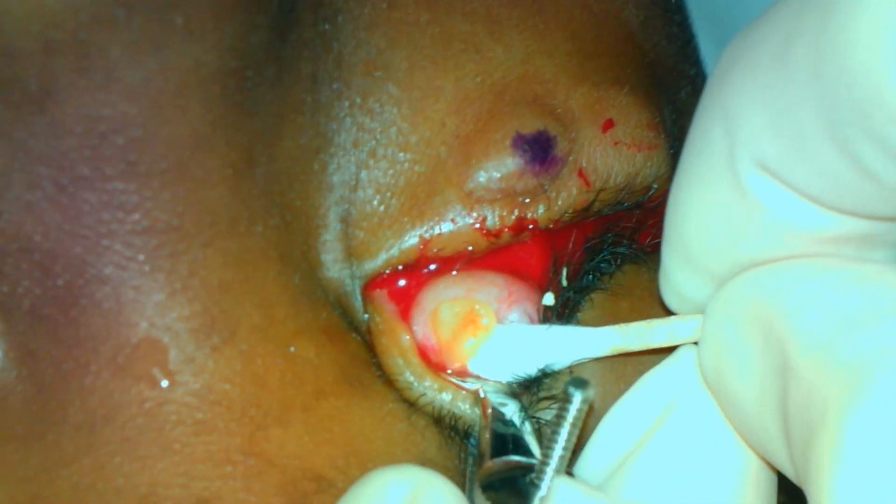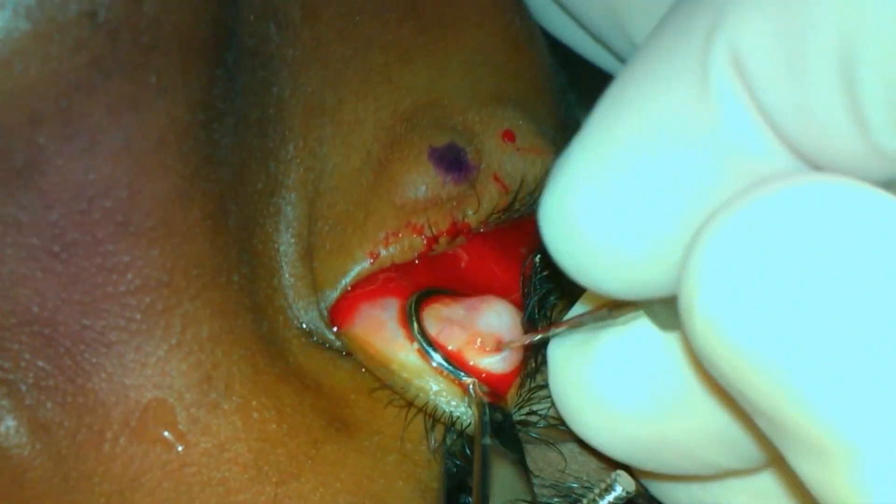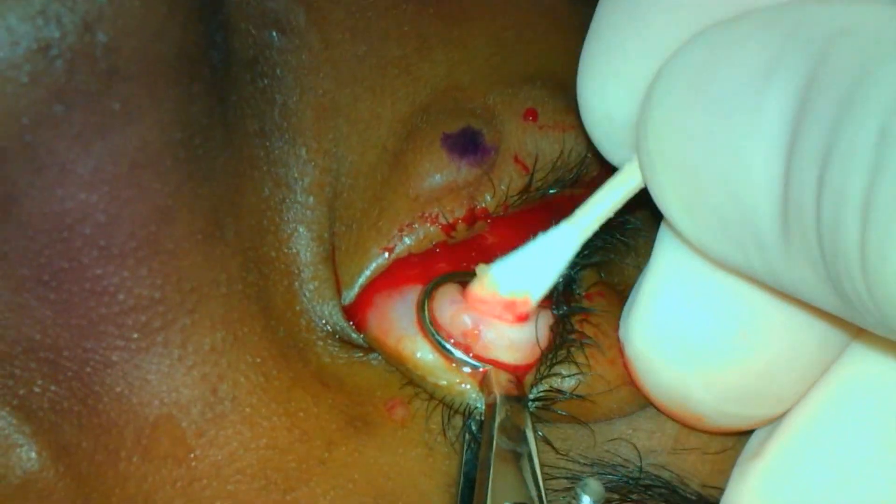The curette is used to remove the contents. Antibiotic steroid ointment will be placed over the area for all of the surgeries and an eye pad will be applied.